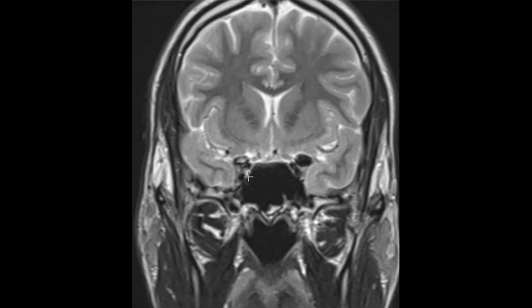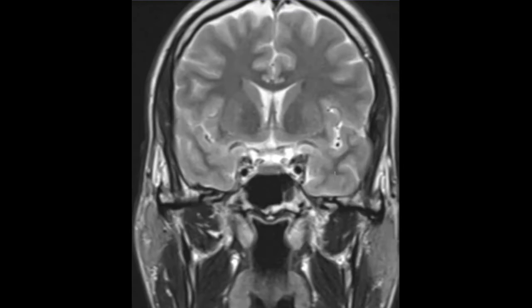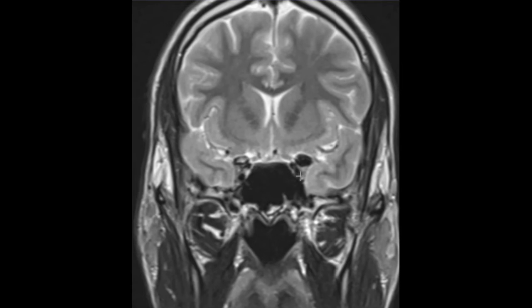Here is another view — the clinoid process on the right and the pneumatization on the left. You can see the carotid artery coming right up to it. When we are not confident, which is pretty common, we will go ahead and get an MRA of the head to make 100% sure this is not an aneurysm.